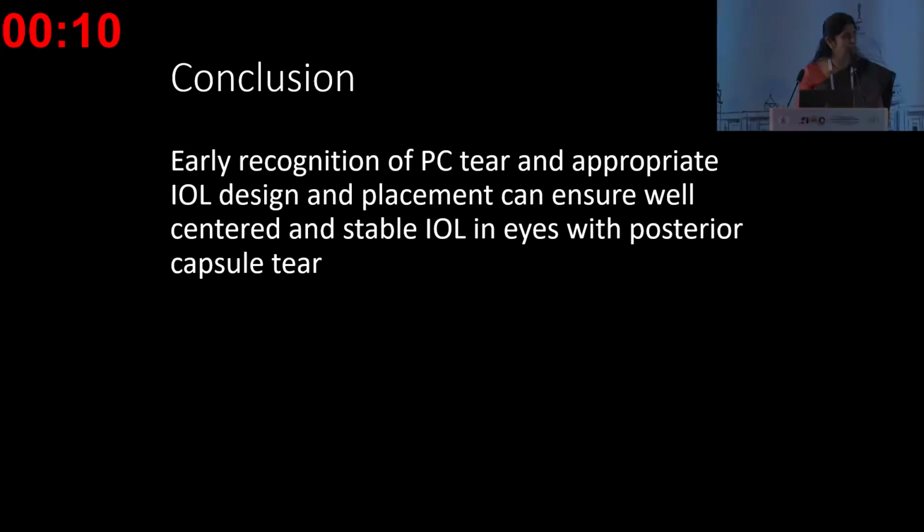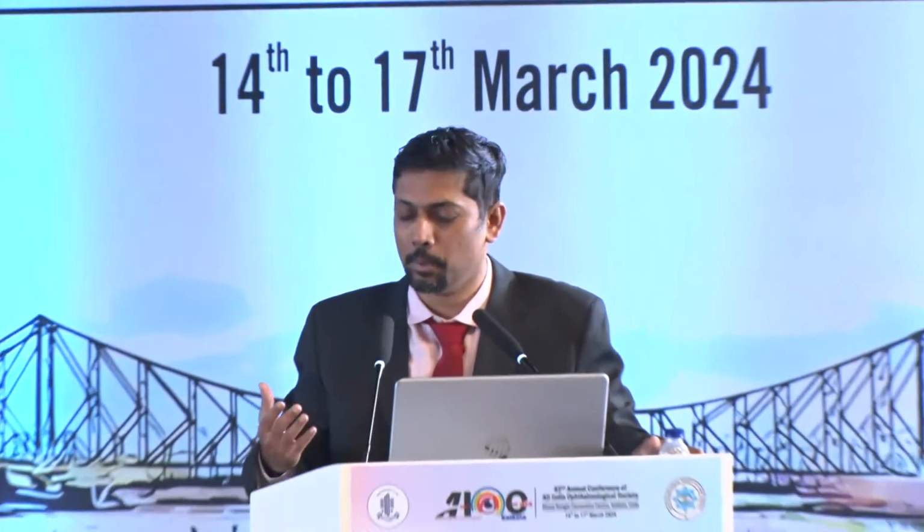Yes, Dr. Prabhu Bhaskaran to go on. After listening to the previous talk, I don't know whether we are really needed, Vivek and I. So anyway, if everything fails and you're not able to place an IOL, we are here to help you out. Can you have the video? So I'm going to show two. I'm not able to see here.